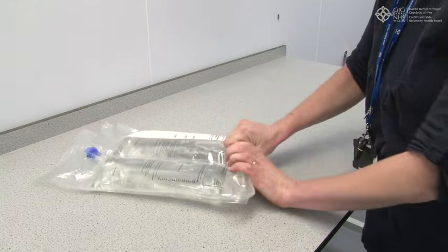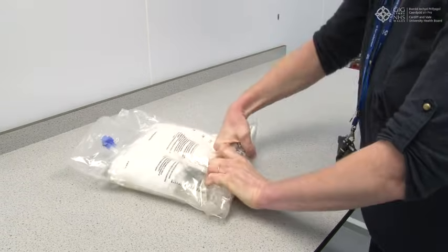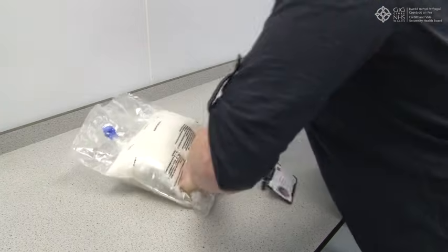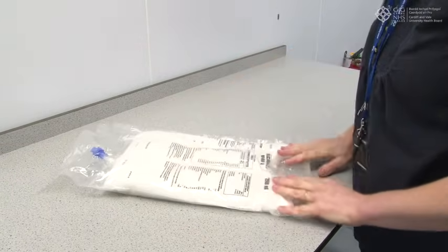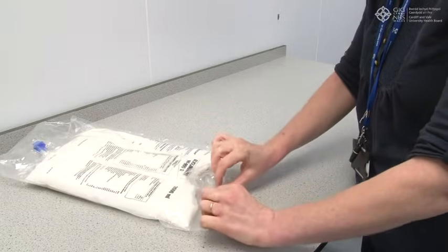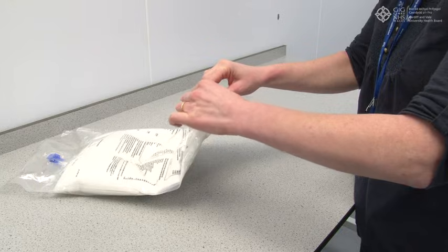Roll firmly the upper bag until the peel seal is fully open. This is approximately halfway.